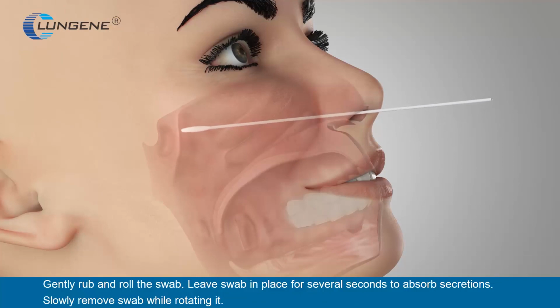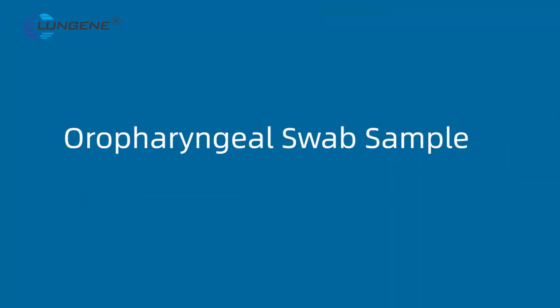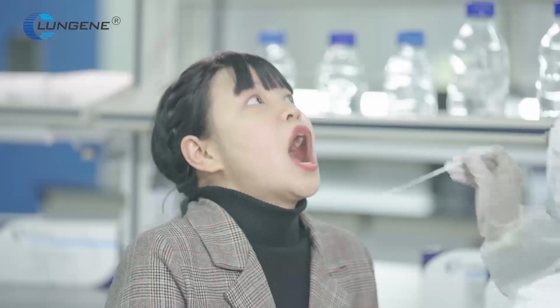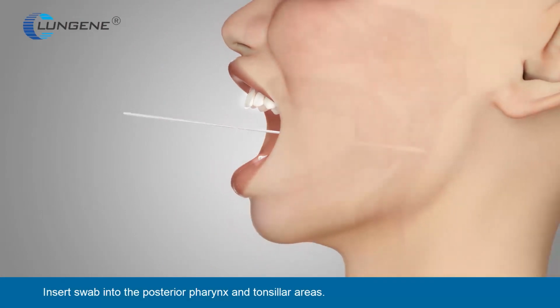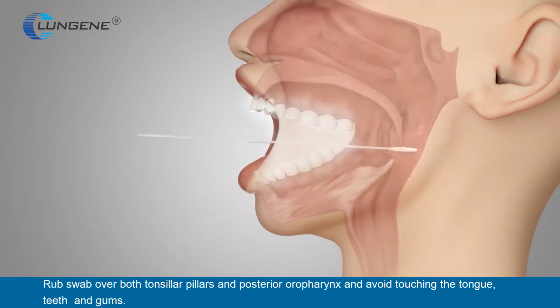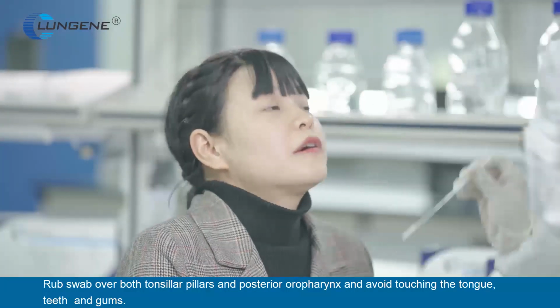Gently rub and roll the swab. Leave swab in place for several seconds to absorb secretions. Slowly remove swab while rotating it. Oropharyngeal swab sample. Insert swab into the posterior pharynx and tonsillar areas. Rub swab over both tonsillar pillars and posterior oropharynx and avoid touching the tongue, teeth, and gums.